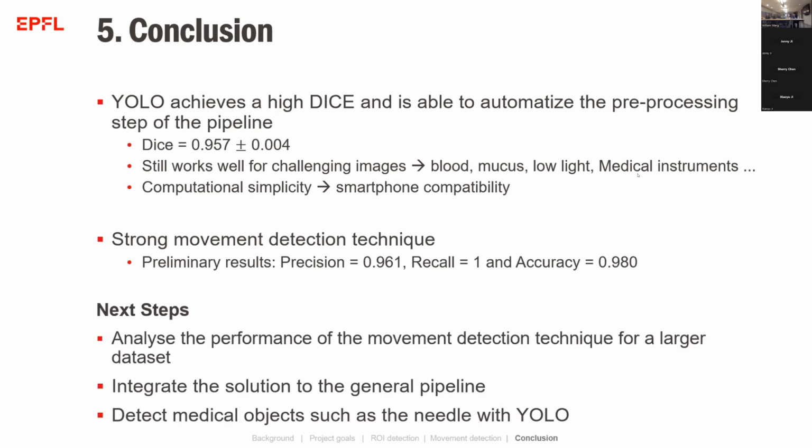So the next steps are to test this method with more data, and also integrate the solution to the general pipeline. Regarding YOLO, we're also working with it to detect medical objects, because this would be interesting to advise the doctor in real time to retake the video if some medical instruments are on top of the cervix, because we cannot use these videos.